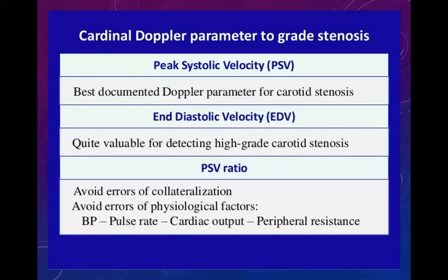So, cardinal Doppler parameters to grade stenosis: we have talked about this, the ratios, the PSVs, the EDVs. We discussed this in the femorals also, the ratios and what they signify, but we'll still touch upon it a little bit. We won't go into the detail as we did in the triphasic and biphasic waveforms last time. The PSVs are the best documented Doppler parameter for carotid stenosis, and EDVs are quite valuable for detecting high-grade carotid stenosis.